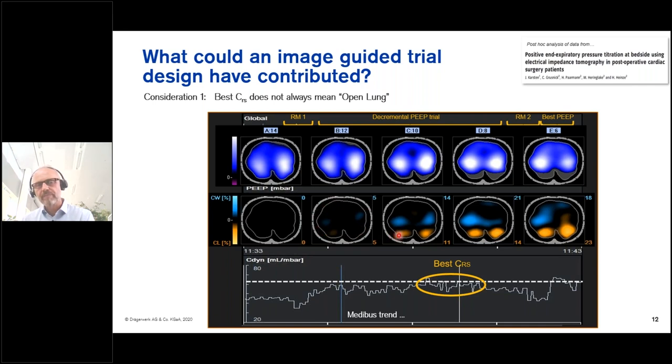But now you see a pattern that is getting stronger and stronger, which means while we are losing dorsal compliance here, that is marked here now in the orange color, at the same time, we win blue areas, and blue is a compliance win. So when we compare the parameters, we can see that 14 is already a higher win in the central part of the body as compared to the dorsal part.